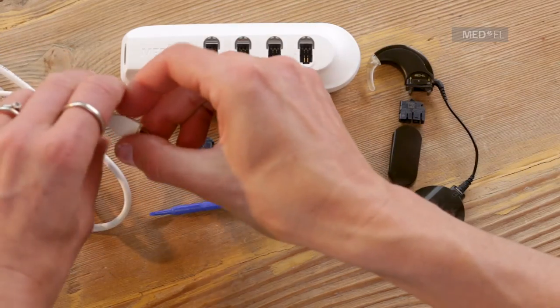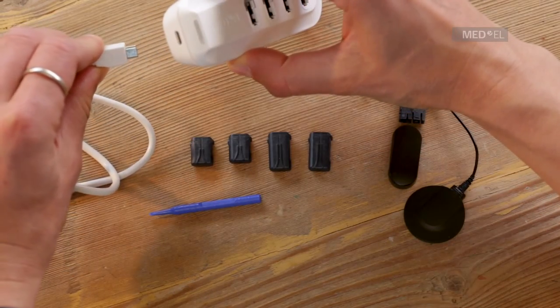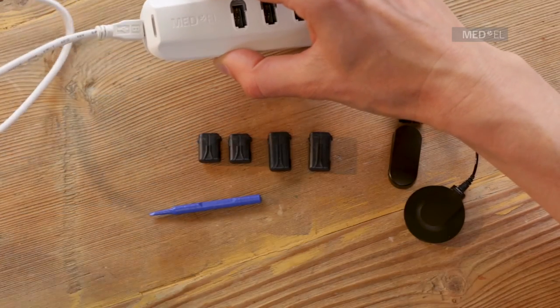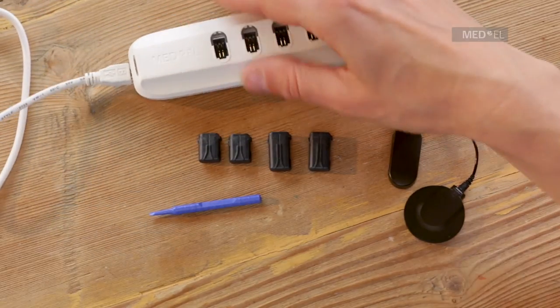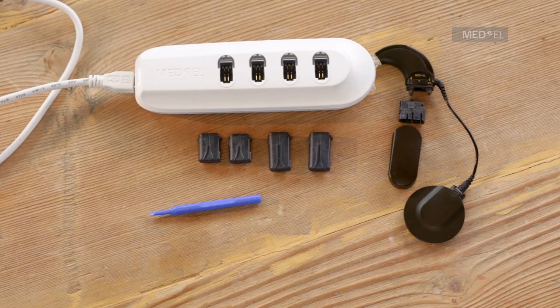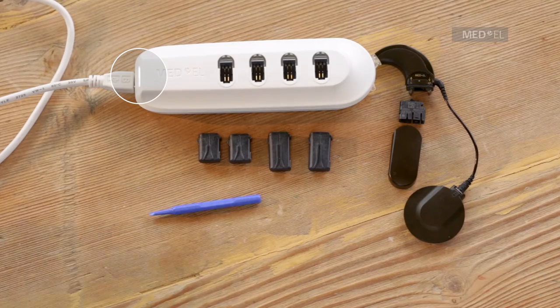Plug in the charger to either a wall socket or your computer. The white indicator light shows that the charger is working correctly.